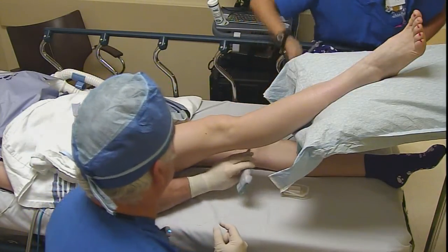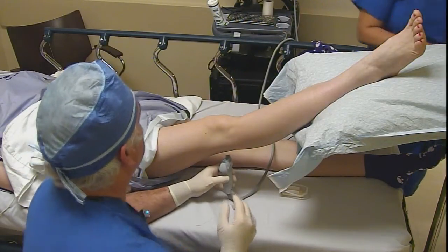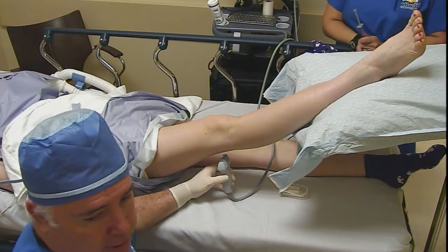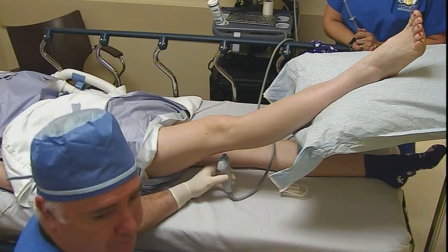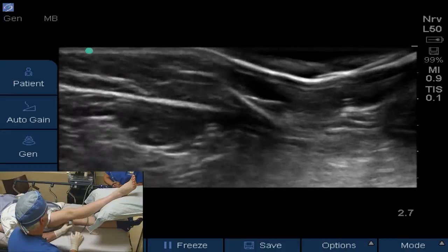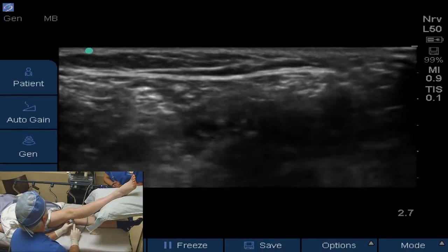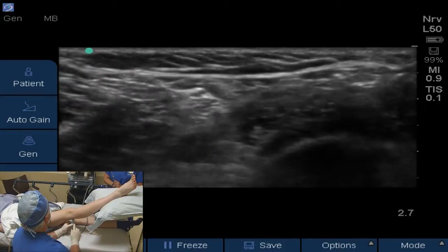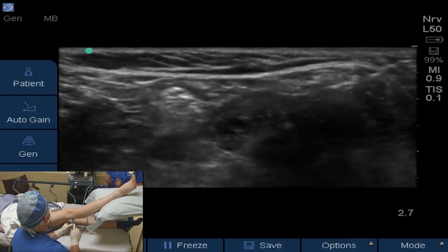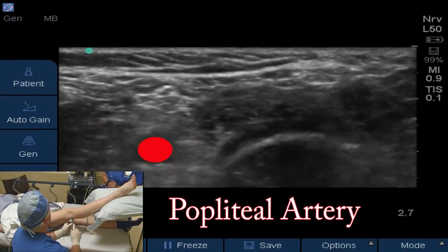We'll bring the probe in from the other side. The right side of the ultrasound screen is going to be lateral, so you can see here coming in. When the right side is lateral, the popliteal artery is going to be on the left side of the screen. Turn the gain up just a little bit more — you can see the popliteal artery beating there.